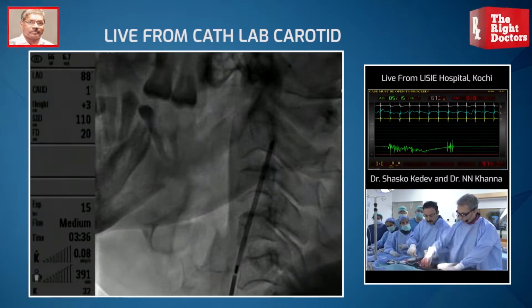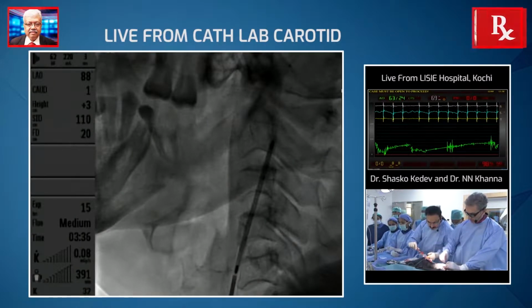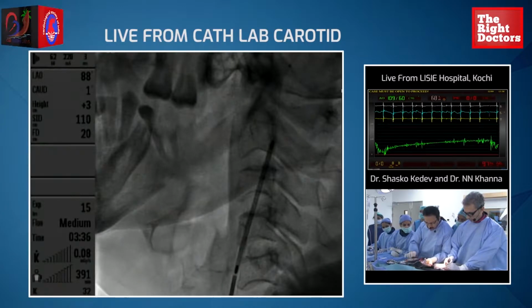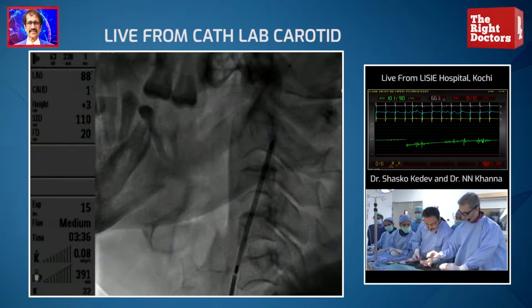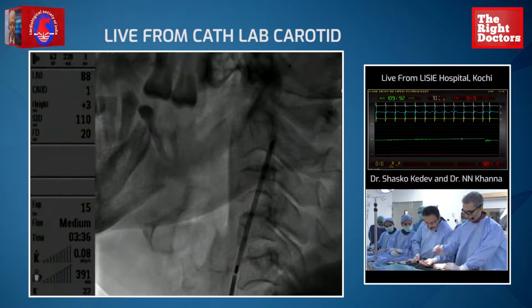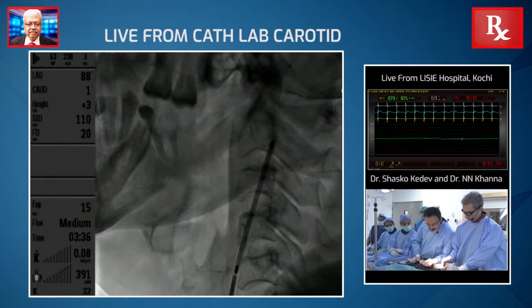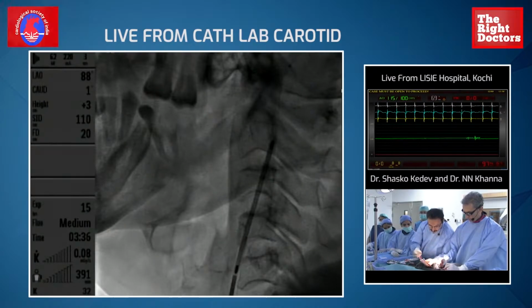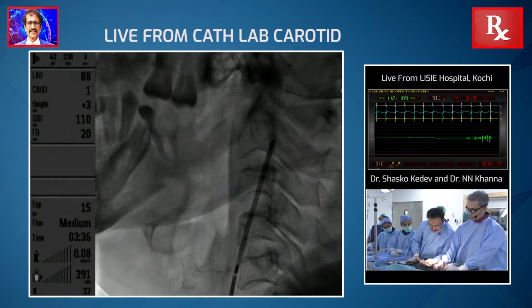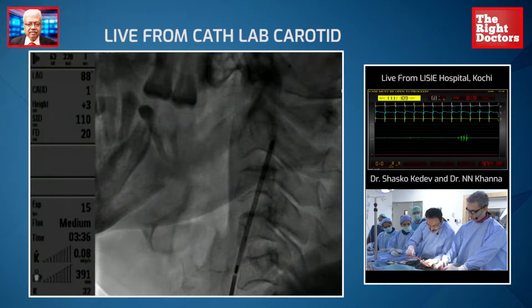At this stage, it's also very important to do de-airing. We need some patience to take the time to relieve the whole system of air, because during the advancement of a stent we are always introducing some air through a Venturi effect. And of course, it's very important to have as short a filter time as possible. We always try to keep it in single digits, between 4 and 9 minutes of filter time.